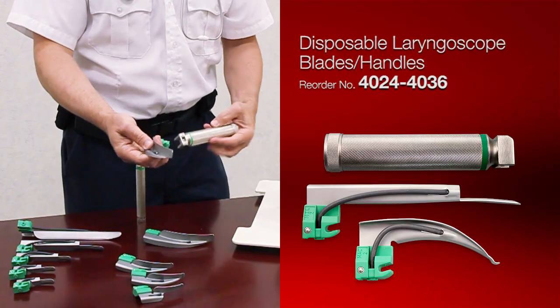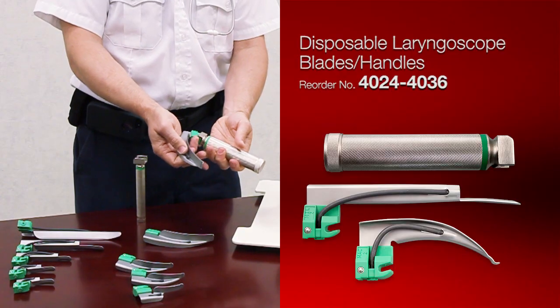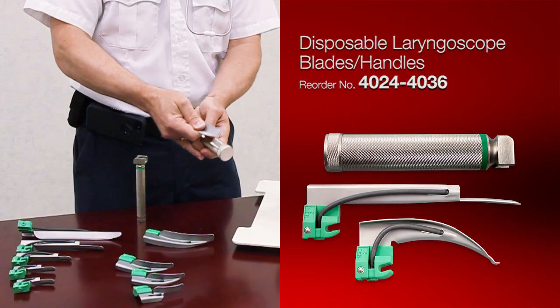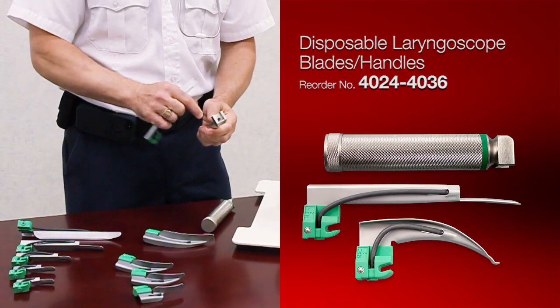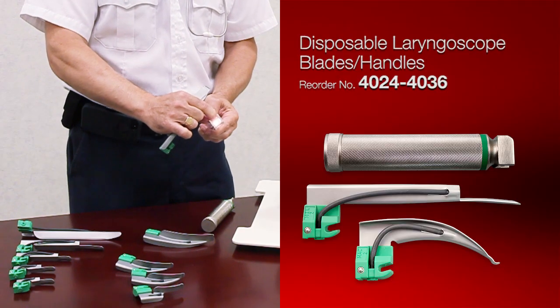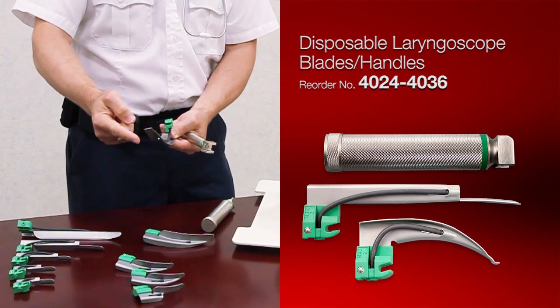The object here is ease of use. You click the blade into the handle and pull it back to complete a circuit, and the light source will come out of the end. The light source is actually in the handle itself — there's a little bulb. Once it's depressed, it lights up and channels the light down through the end.